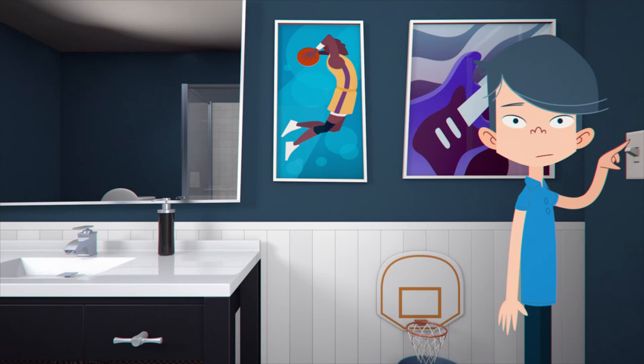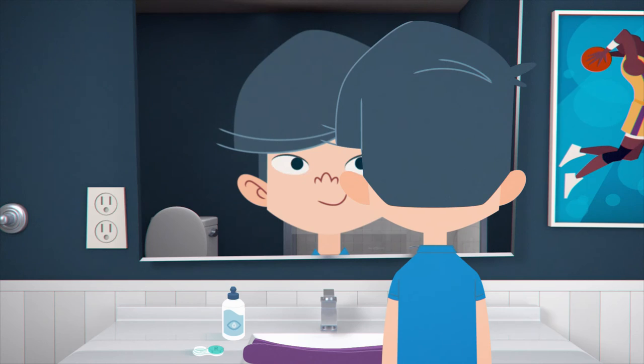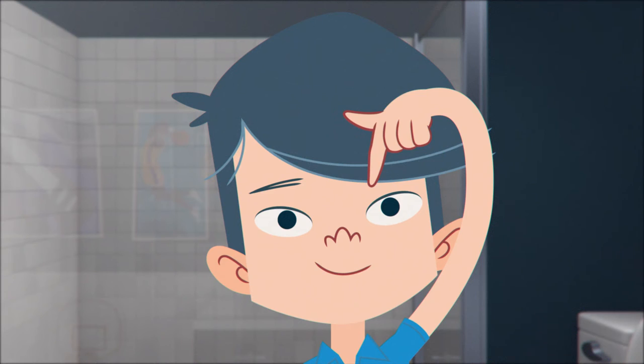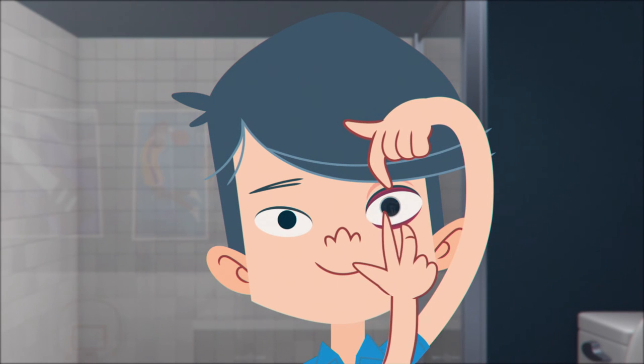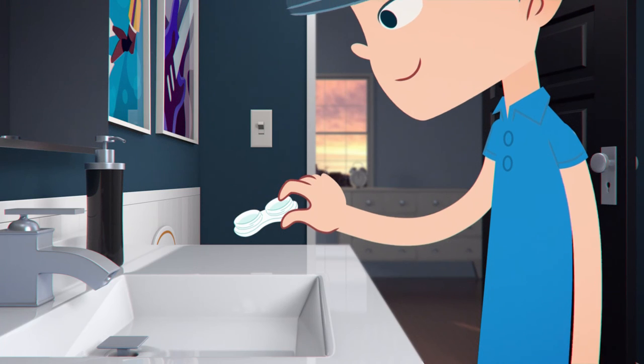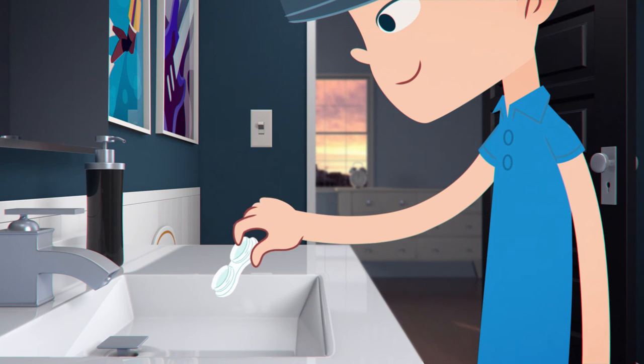Morning James! Fresh, clean lenses. After you've put your contacts in, you'll want to discard the solution left in your case from the previous night.